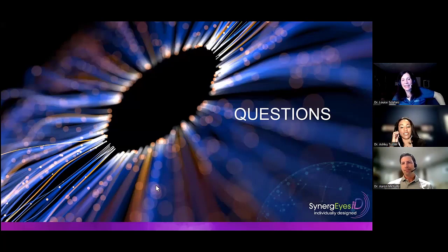Dr. Sclafani, what is the max cylinder that this lens can correct? Whatever corrects. I have patients at about 4.5, which is probably my highest, but we hear stories of it being even more cylinder. But remember, when you're doing it, you need to go with a steeper base curve. That's what we found over time. In the beginning, because it is a mono curve, we were kind of shying away from going any steeper than 1 diopter over flat K, but don't be afraid to do that. You can go steeper to get that maximized.